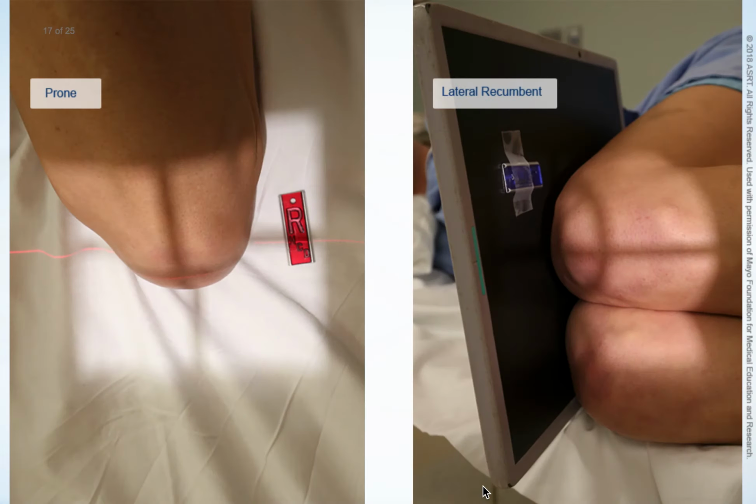Anatomical markers are placed on the image receptor to identify the anatomical side that is being examined. The patient's gonads are shielded, and the shield is placed between the X-ray source and the patient. The patient's thyroid and upper body also are shielded if the central ray is directed toward the thorax. The patient is instructed to hold very still, but no breathing instructions are necessary.